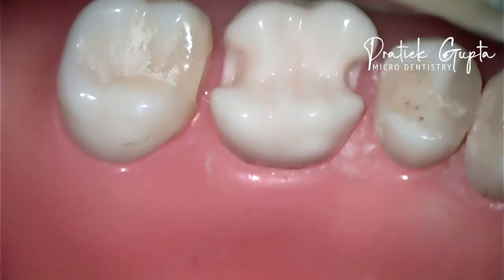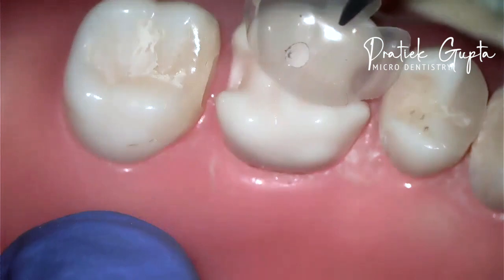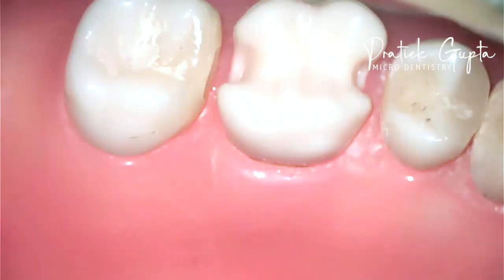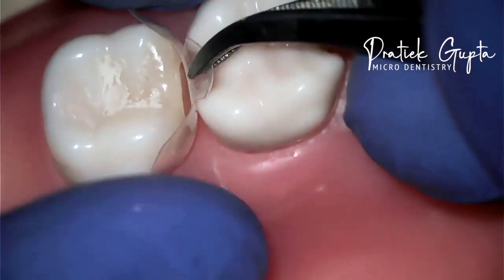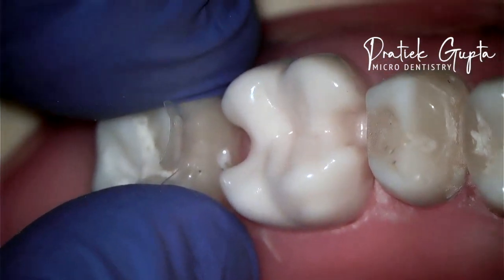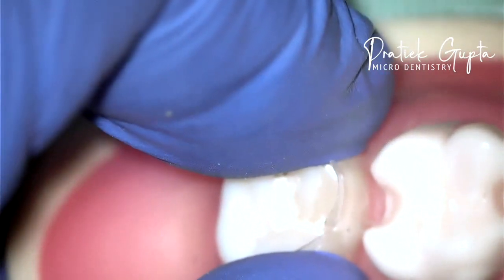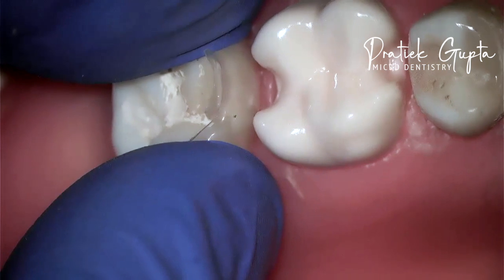Another way of restoring it is to take your matrix and punch a hole. I have punched a hole right in the center of the matrix by using the rubber dam punch — specifically the Sanctuary rubber dam punch, using the third number hole. Now, if the cavity extends buccolingually too wide, I would want to do this: put the matrix in place, and once it is seated, use that hole to put your flowable through.